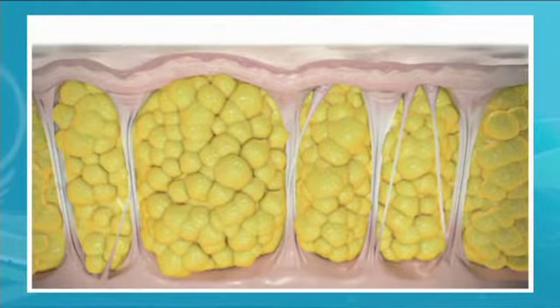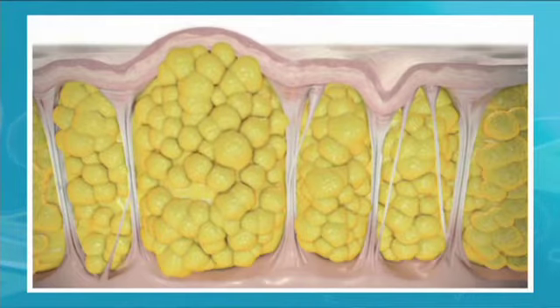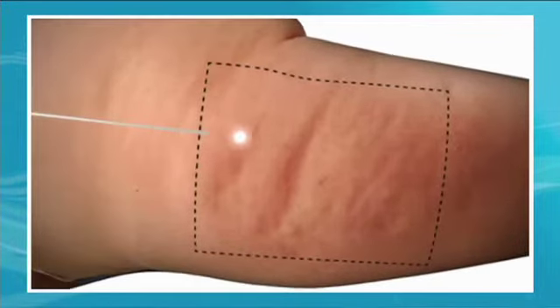The three anatomical components to cellulite that we're going to be treating with this therapy are the fiber septi. They create the valleys. They connect the dermis of the skin to the underlying muscle fascia. So we need to divide those. Also, we're going to treat the fatty component to a compartment. The fatty component creates the hill. So the hills and the valleys, but that hill, if we can take some of the fatty component out of the compartment, we're going to decrease the size of the hill.